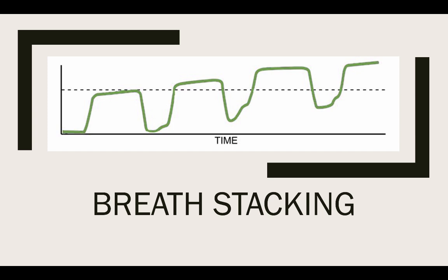So how to quickly fix this? You know what? Disconnect the ventilator. Pull off your BVM. Exhalation is a passive process. Pull it off for a few seconds. Let that passive exhalation occur, and then start your ventilations again.